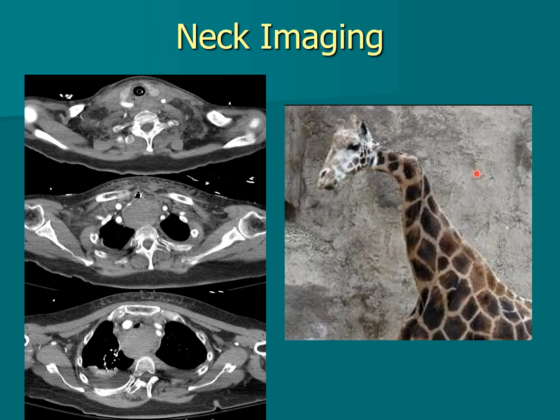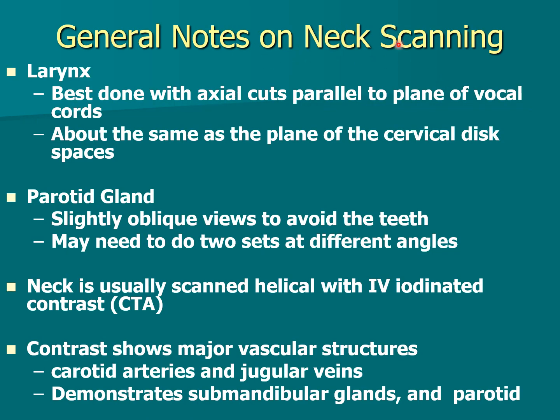Neck imaging, I'm not going to say much about this because I don't know that we do neck imaging to see the carotids and to do an arteriogram, and then we do the spine imaging, but I don't know that we call it neck. We would say we're doing spine imaging over the cervical area, but your book puts neck imaging, so I'll say that too. General notes on scanning of the neck. I have never done a scan where they said we want to see the larynx. I've just never done that.